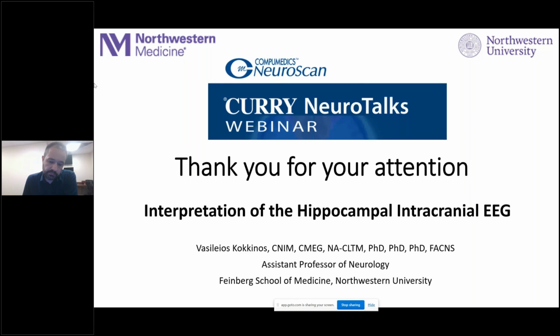Excellent. We have a question from Jay Singh. Do you look into interictal infraslow wave activity? Is there any significance there?